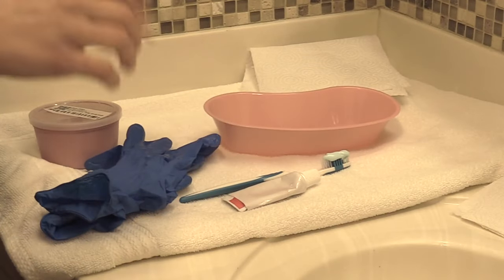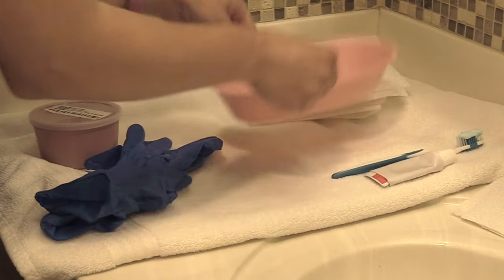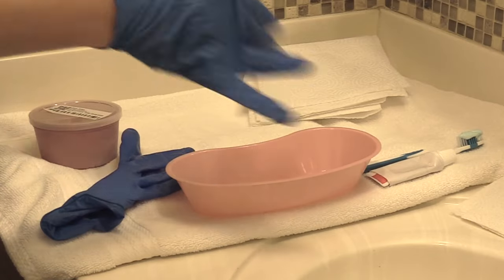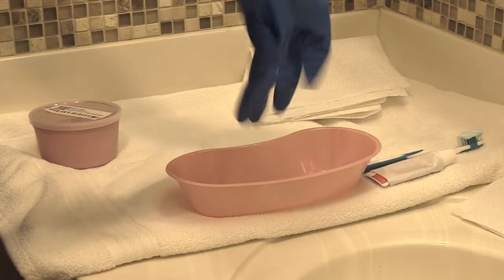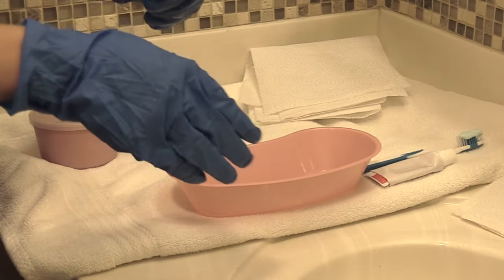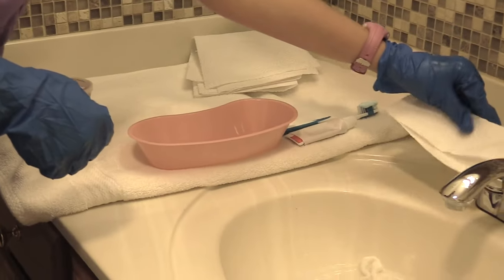Now we're ready to clean the dentures. We're going to don our gloves, because anytime you are touching dentures you need to always wear gloves to protect yourself from germs — the mouth has a lot of bacteria in it. We're going to turn our water on warm. We don't want it hot because it can damage the dentures, and we don't want it too cold because it really won't do the job.